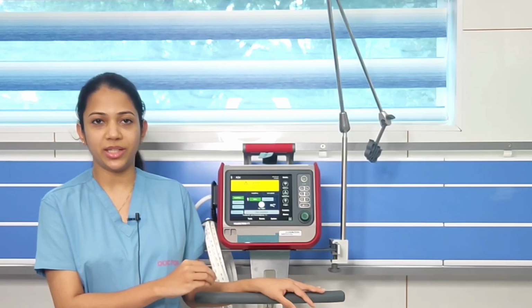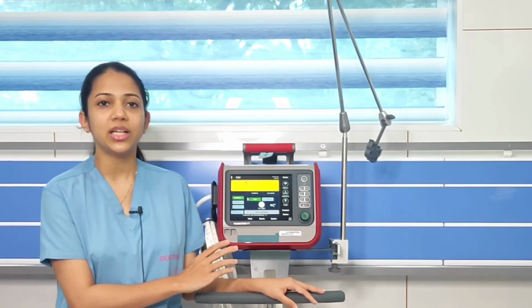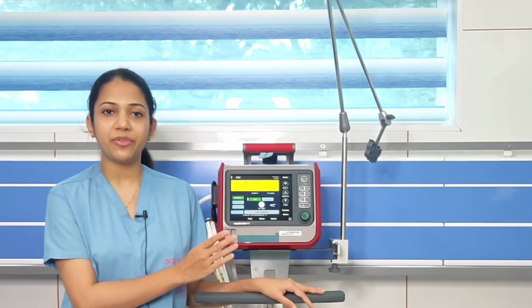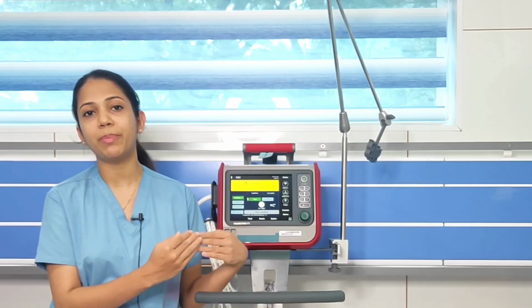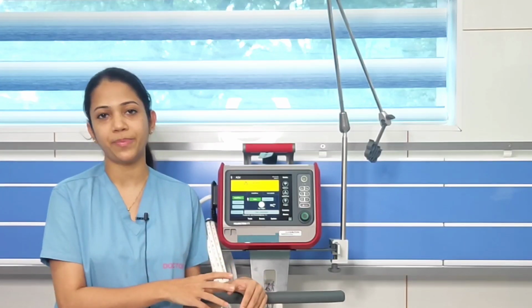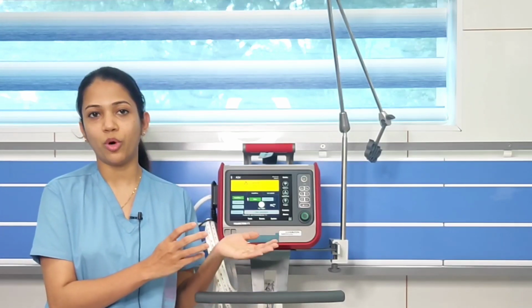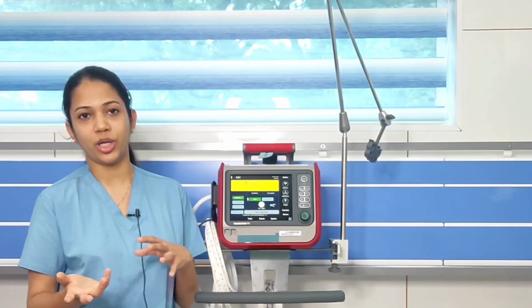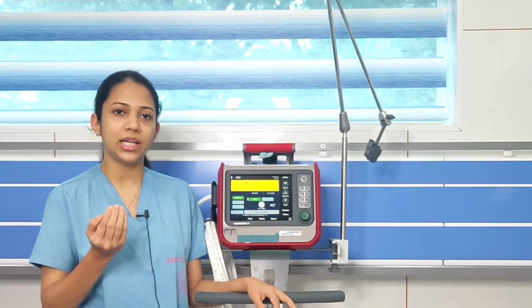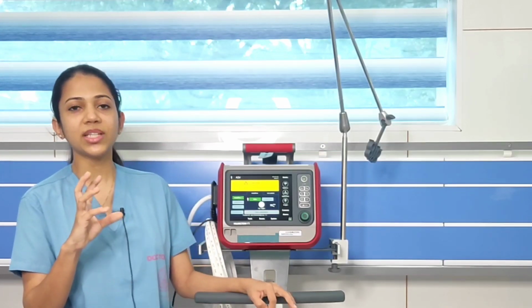So what is pressure trigger? Suppose we have a ventilator which has a pressure trigger to set. I have a Hamilton ventilator here, which is sensing flow trigger, but if you have a pressure trigger, depending on the difference in pressure, the ventilator will sense that the patient is making a respiratory effort and will support the patient. We can set the pressure as -5 centimeters of water or -1 centimeter of water. Depending on the pressure we set, the ventilator will sense whatever effort the patient is making, and will support the patient.